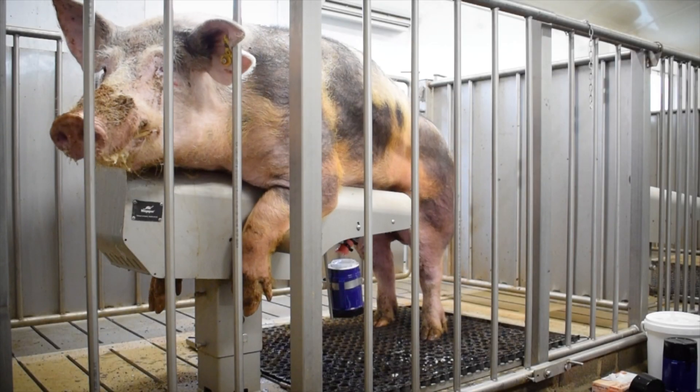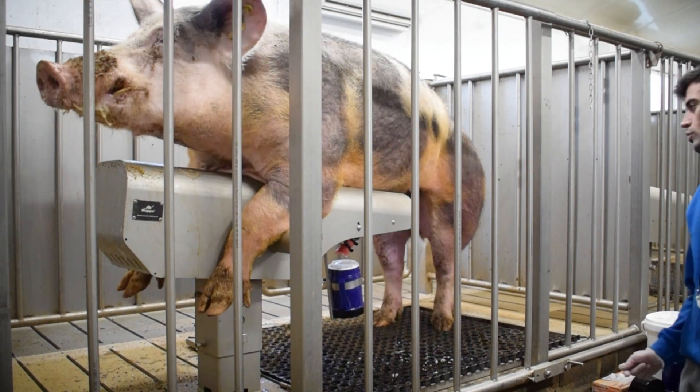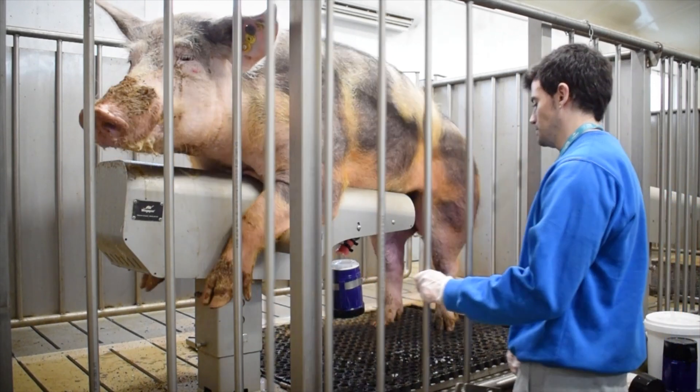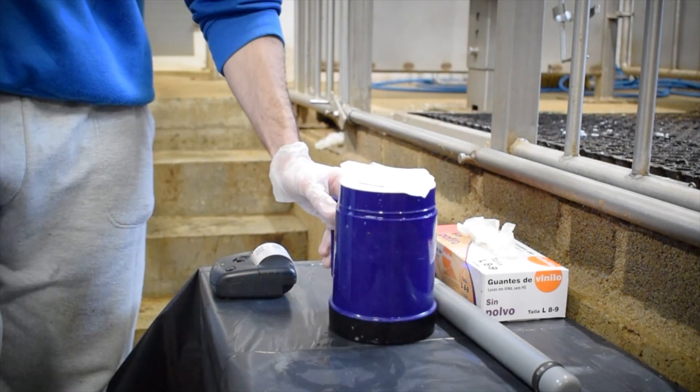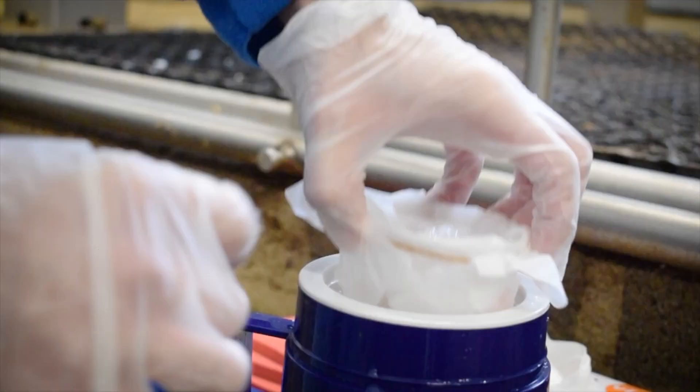When the boar finishes, the relaxation of the penis causes it to be released automatically from the cervix and collection support. Once the extraction is completed, the printed label is placed through the GSP traceability system, which will accompany the ejaculate to the analysis laboratory.